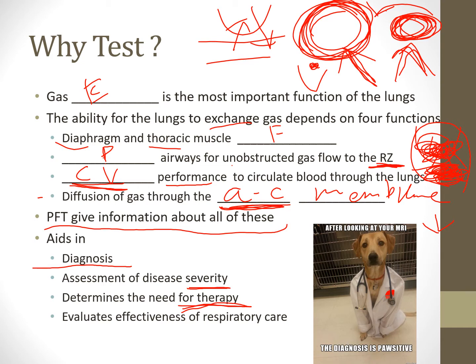That ultimately too, here's one of the really cool parts about this, is we can actually show numerically, right, with measurable results, how much the patient responded to what we did. So let's say I have someone with asthma and their airways are really, really small, right? Bronchospasm caused their airways to be really, really small and constricted in. And then I gave them a bronchodilator.